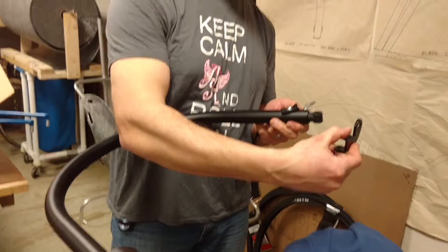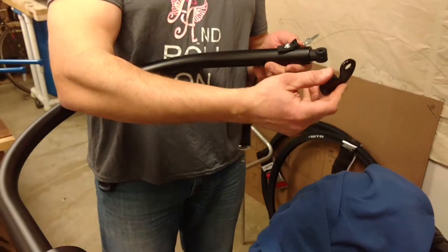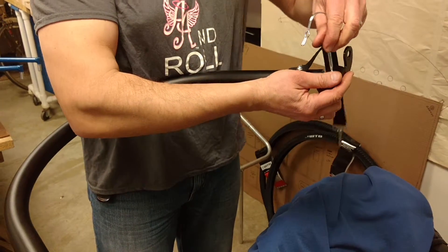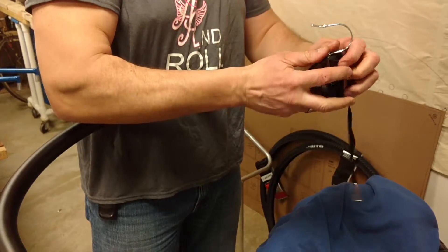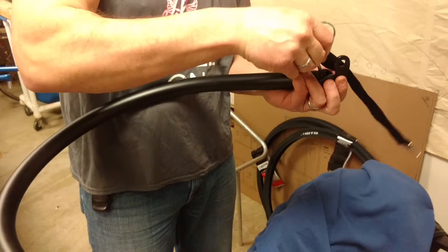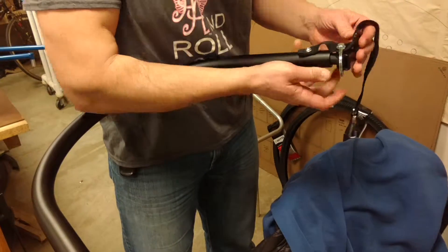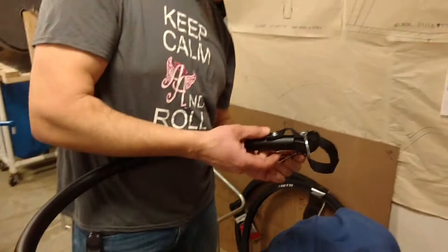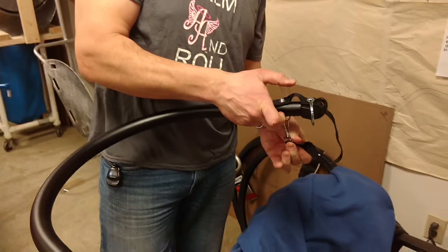This end goes to the bicycle that you would have installed on your quick release before this. Roll the chair up and this goes through here. Slide the locking pin in — it's easier when it's on the bicycle. Make sure that's locked. Put the safety strap around the rear triangle on the bike frame, and you're ready to go.